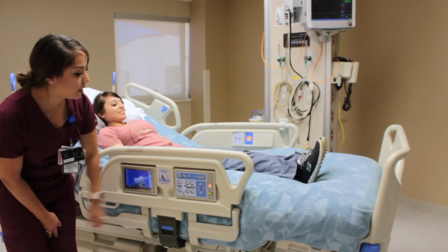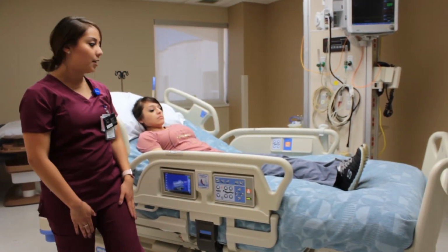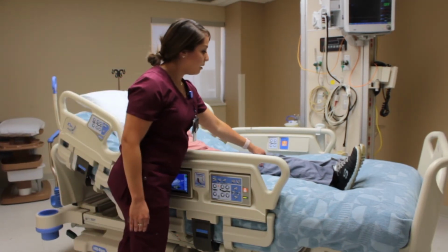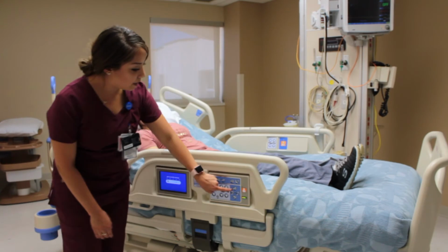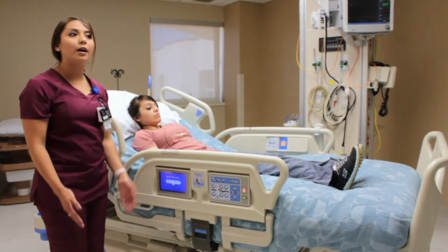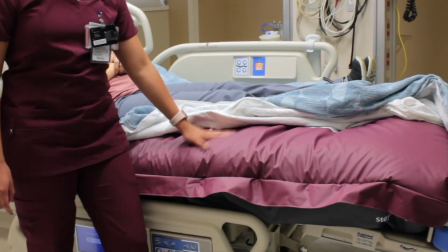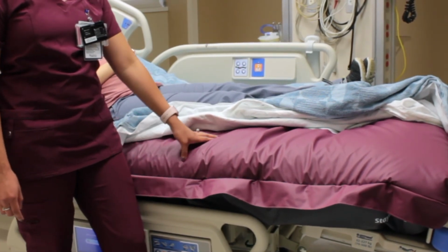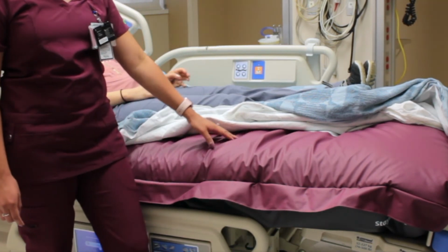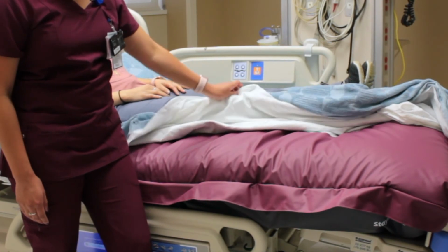A lot of patients that we get also, doctors have an order for us to elevate their foot of the bed, and back with our old beds, it would just basically bend at the bend of the leg. Now it does have the ability to bend the bottom half of their legs to where it's more effective also, and it helps with circulation and helps us prevent blood clots. The progressive bed surface comes with an advanced feature such as the microclimate management that keeps the patient's skin cool, dry, and comfortable, and that helps prevent skin breakdown a lot.